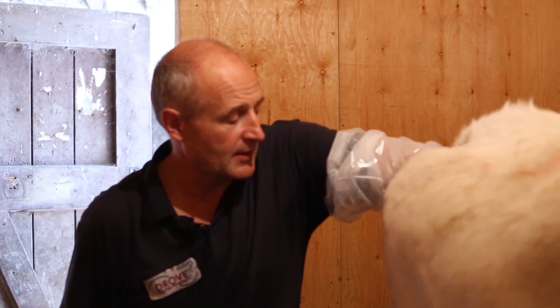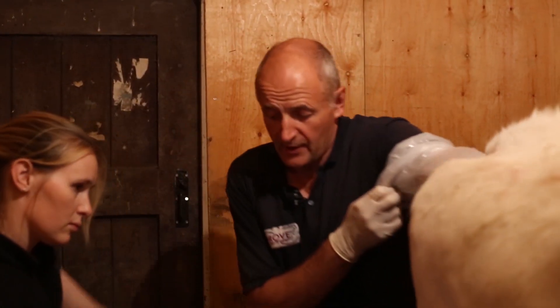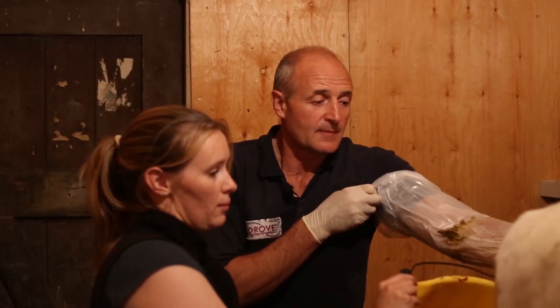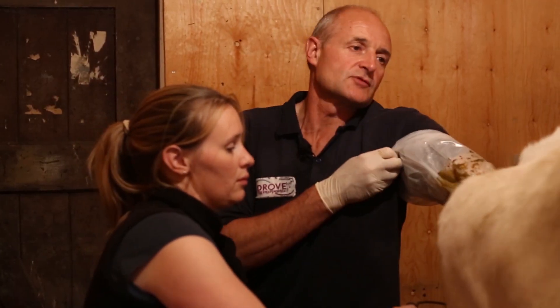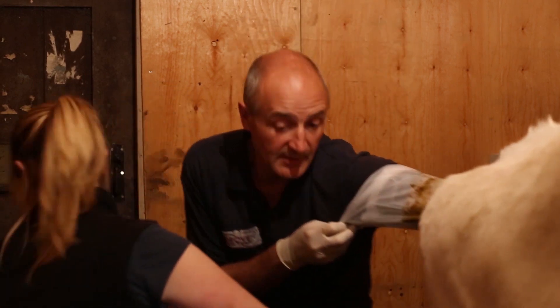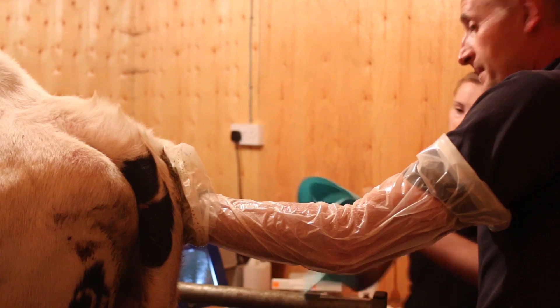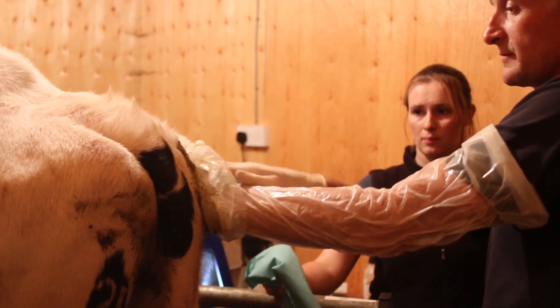Now before we put the ultrasound probe into the vagina, I've got to empty the rectum out so there's nothing in there except for my arm and the rectal wall, to make it easy for me to grasp the ovaries and place them in closer position to the head of the probe.